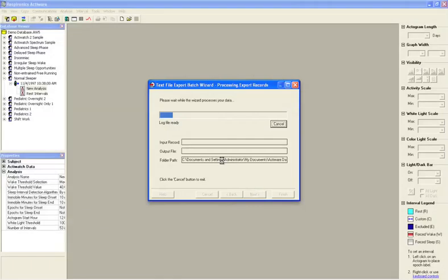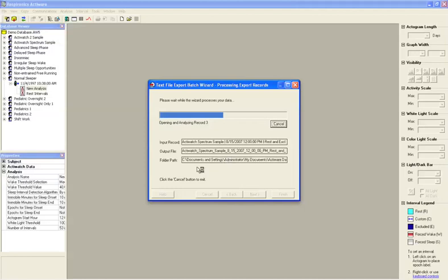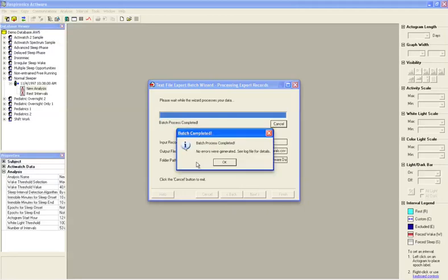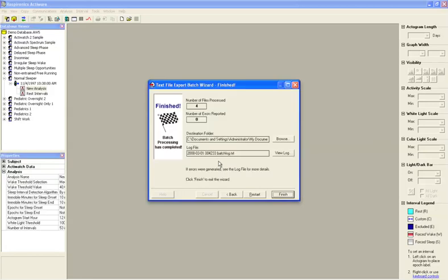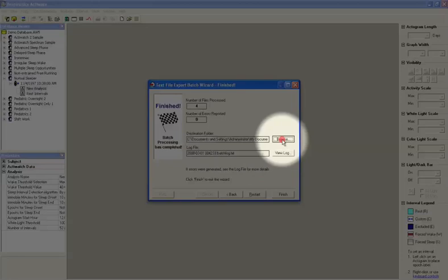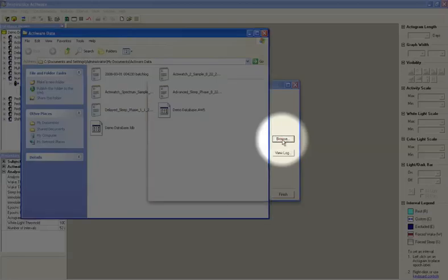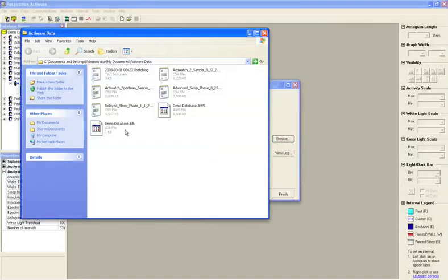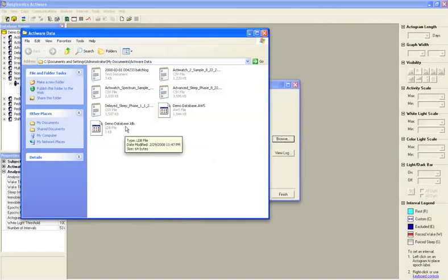At this point, it will go ahead and generate these export files for you in the location you've specified during the course of the wizard. Once this export routine has been completed, you'll be able to view and browse those files at any time. In order to locate those files, click the Browse button and you'll automatically be taken to the location where those files were saved.